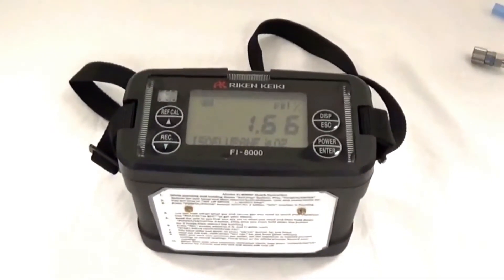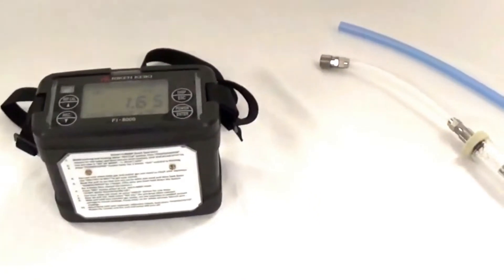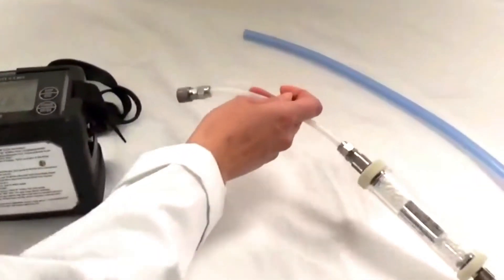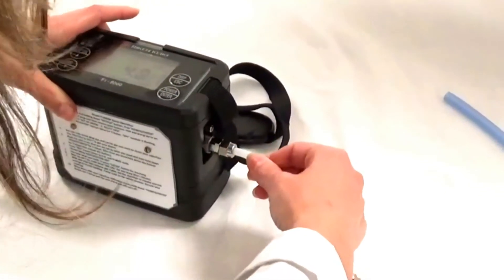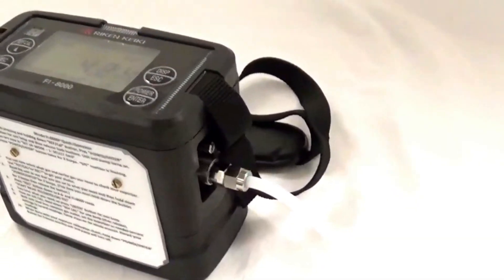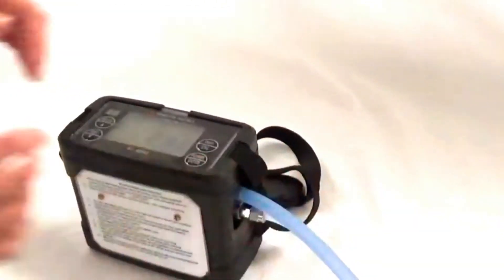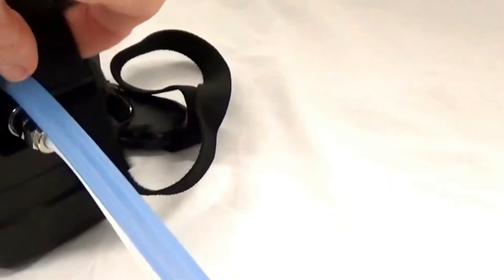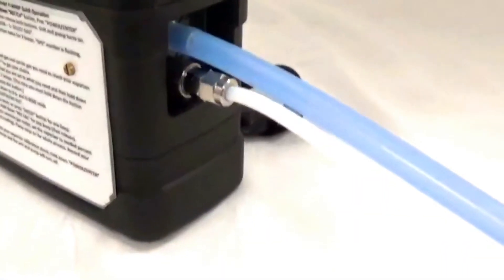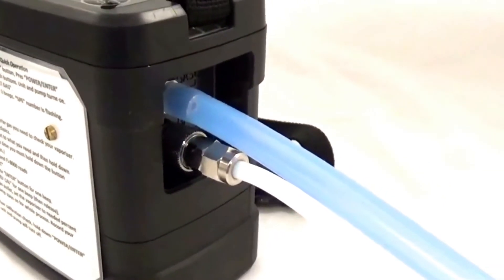With the Reichen meter still on and the air cal value being displayed, we will now connect the Teflon sampling line to the gas in port and make sure it snaps and locks in place. We will now connect the blue scavenging tube to the gas out port. On this particular unit there are only two ports — gas in and gas out — with the gas in being on the lower side.